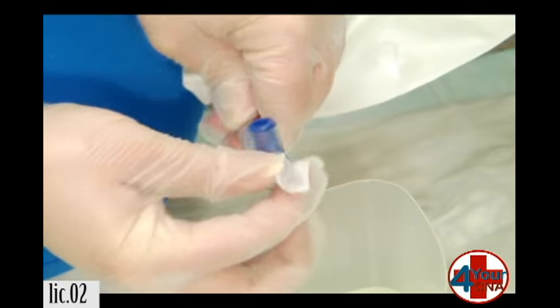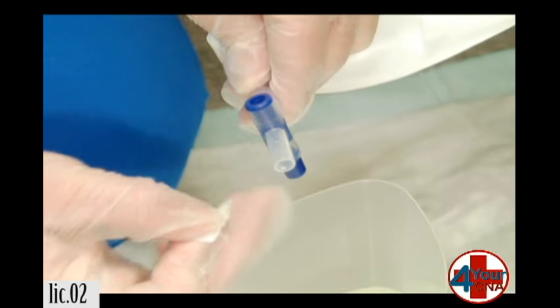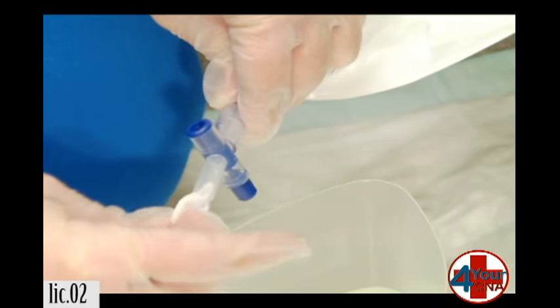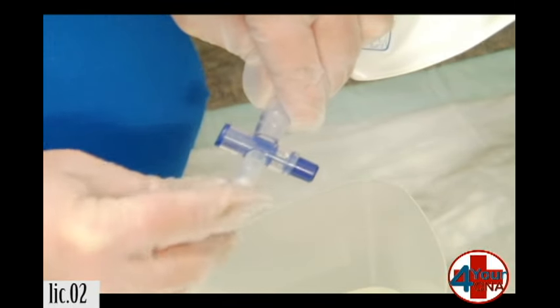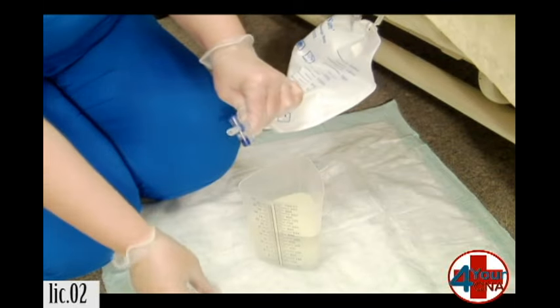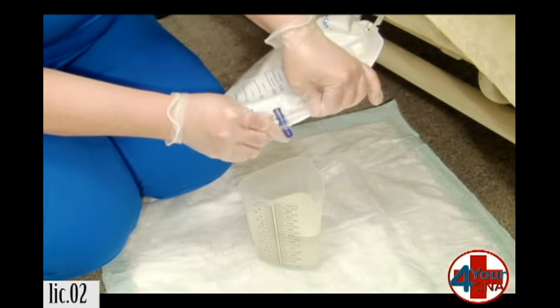Take an alcohol pad and wipe off the outside. Roll it up and clean just the very tip of the inside — that way if any bacteria did get in there, we'll get it before it enters the bag itself. Once the port is clean, we'll very carefully insert it back into its housing.